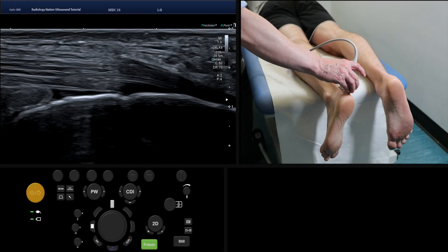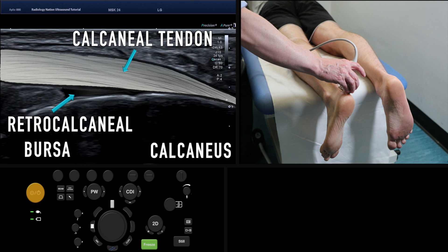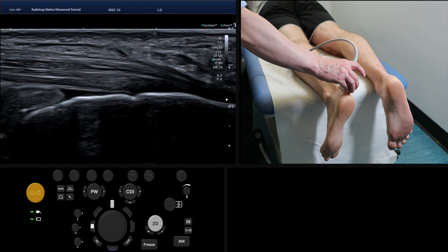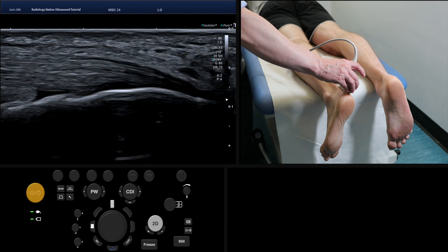Start with the probe in longitudinal orientation, with the heel of the probe on the most distal part of the patient's Achilles tendon. At this point we see fibres of the tendon at their insertion into the calcaneus, and we see a fluid attenuation triangle called the retrocalcaneal bursa.